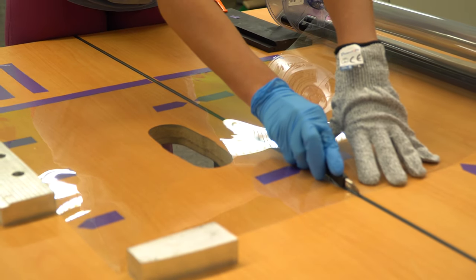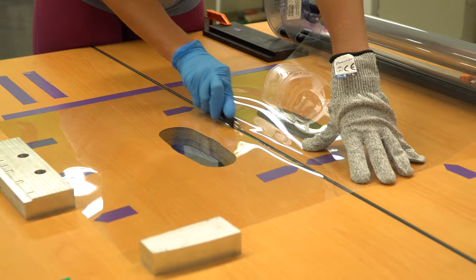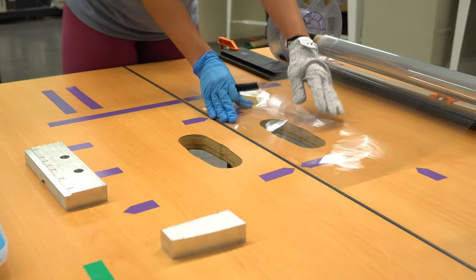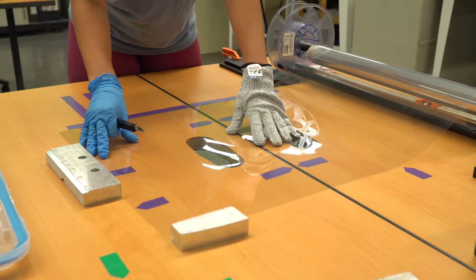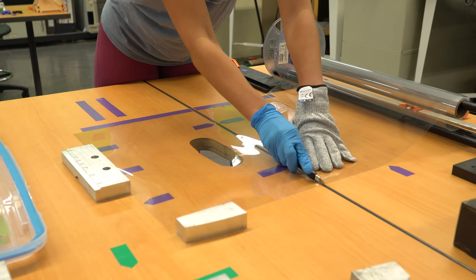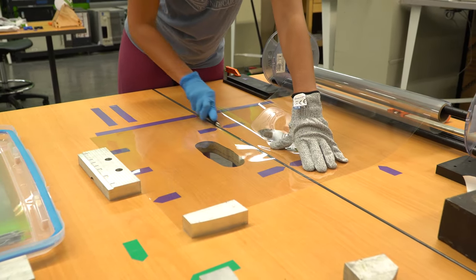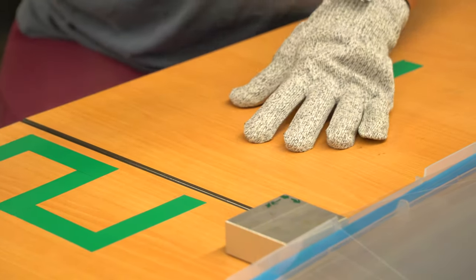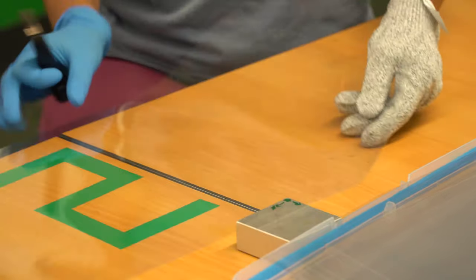The first step to manufacturing these face shields is to acquire high quality plastic film. Plastic film as thin as 5 mils or 0.005 inches is possible to use, although 7 mils or 10 mils is preferable. The films can be cut completely manually or with the assistance of a laser cutter.